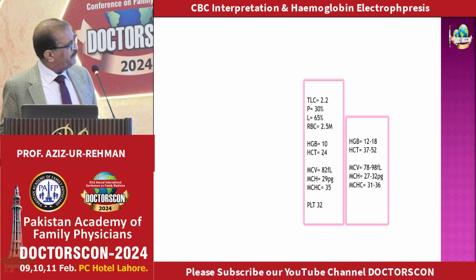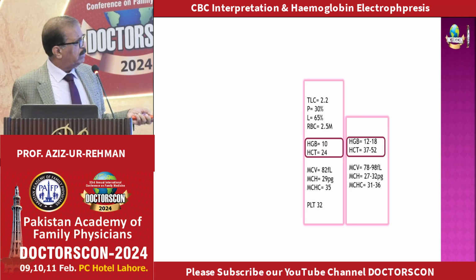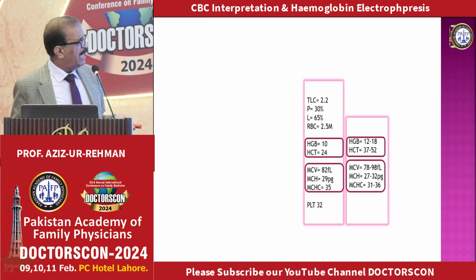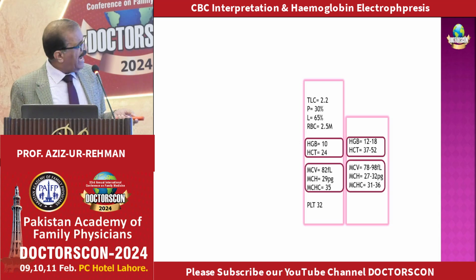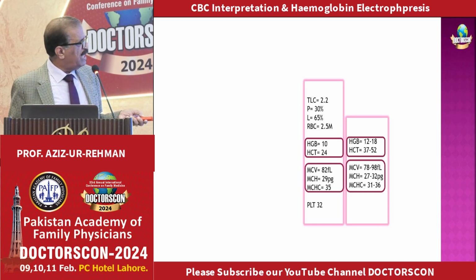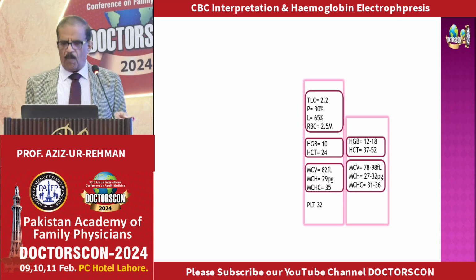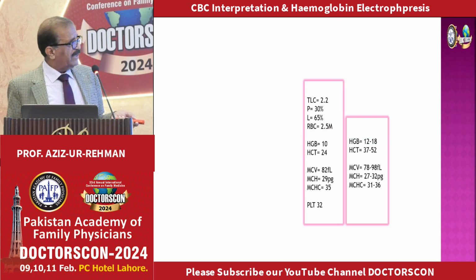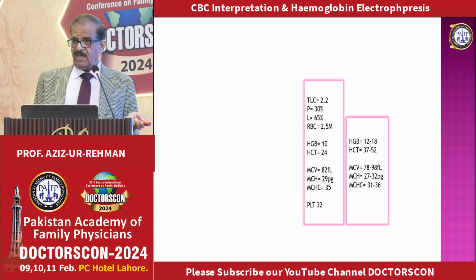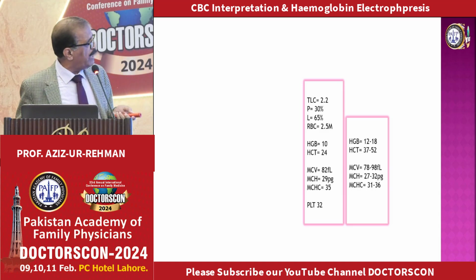So, last case, this is another CBC. HB is low and hematocrit is low. So first step, the patient has anemia. In the second step, look at this. MCV is normal, 82, it falls within the normal range. MCH, again within the normal range. MCHC, again within the normal range. So what do you say? There is anemia, but red cell indices are within the normal range.